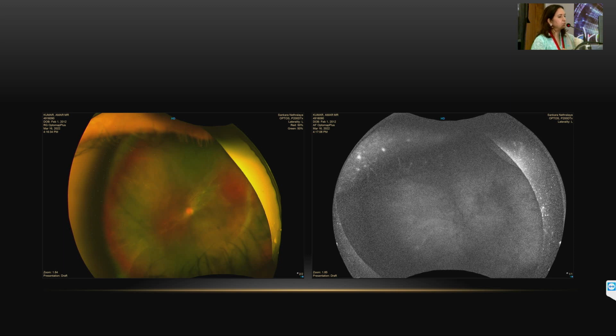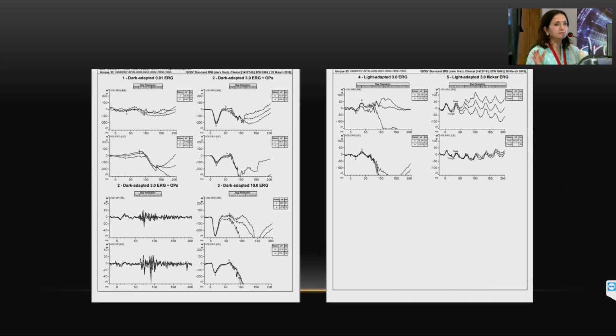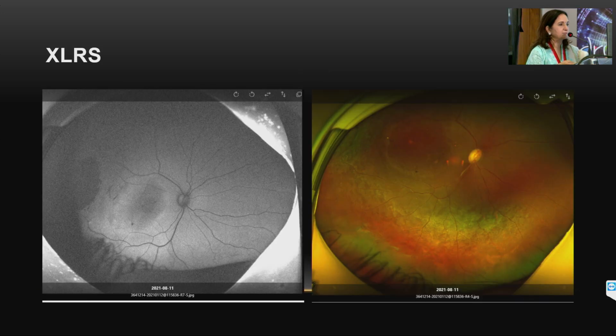So this is how it helped me. A young patient, and I saw marked loss of vision, but I didn't think that it was a split. Actually the split had happened, and already the area was totally atrophic, and this is the corresponding ERG. If you see the ERG on the left hand side, the amplitudes of the negative waveform are even lesser compared to the right, so it is helping you prognosticate as well. If your amplitudes are lesser, it means the disease is worse.